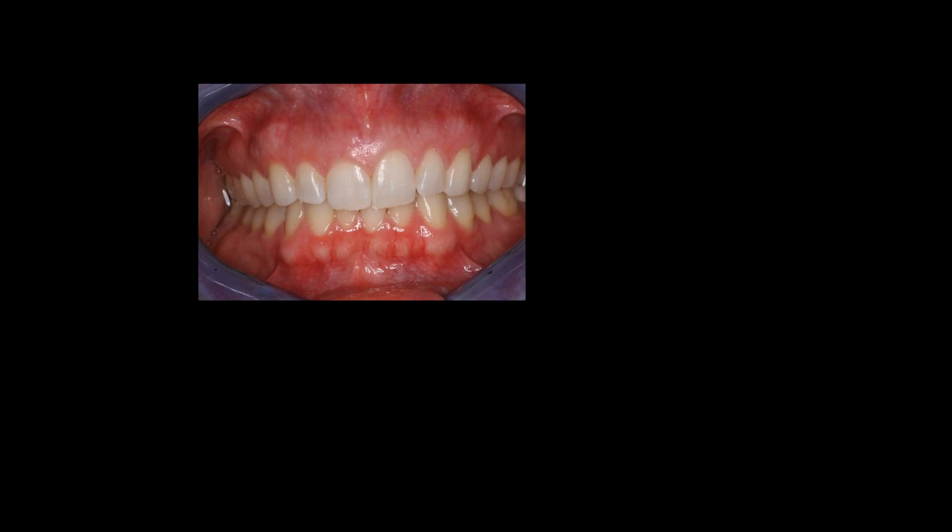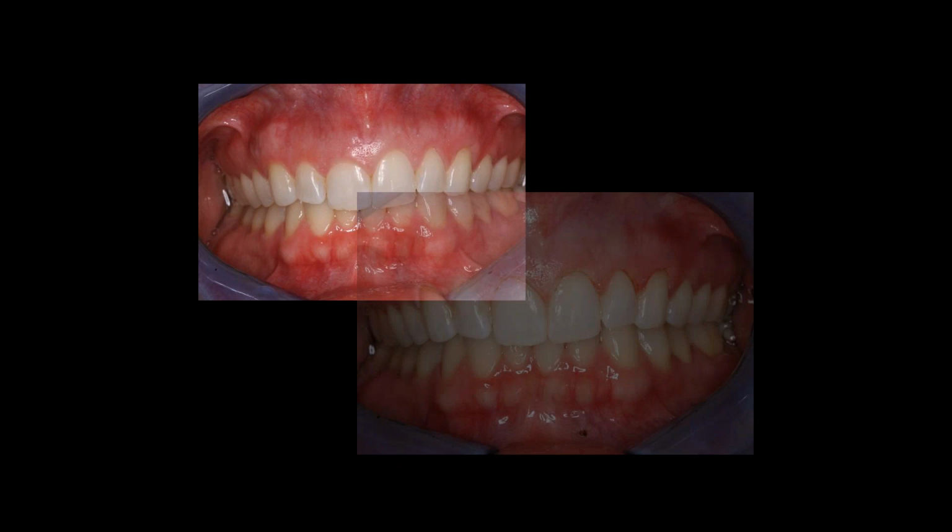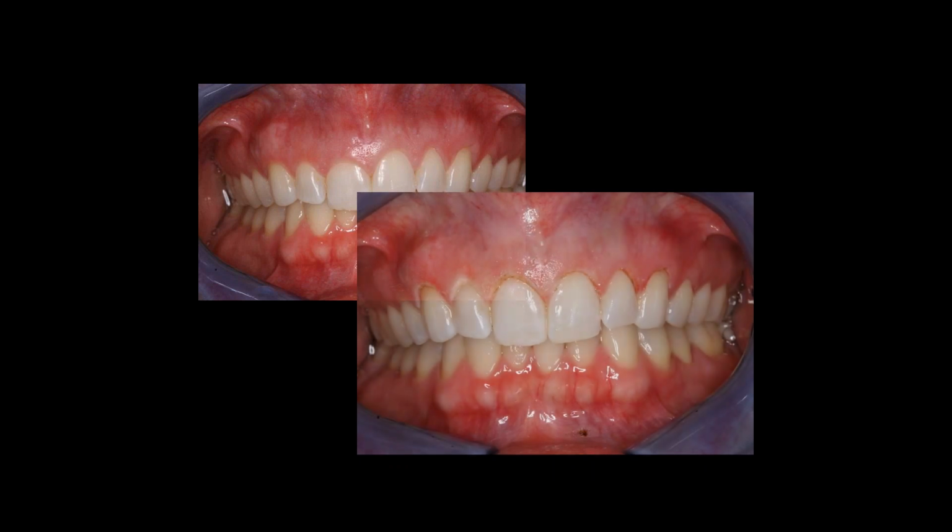I've had a couple that allow me just to do it right there in hygiene. I've had a couple that have come back and said, hey doc, ever since you told me this, I look at it every time I look in the mirror. Can you please even these teeth out? So again, topical, just tissue recontouring, everything looks more balanced. The tooth shape totally changes on the right central and the right lateral when the gingival tissue is recontoured.